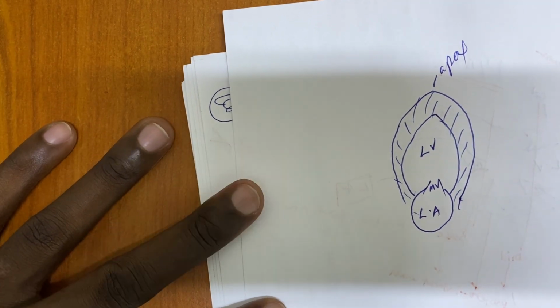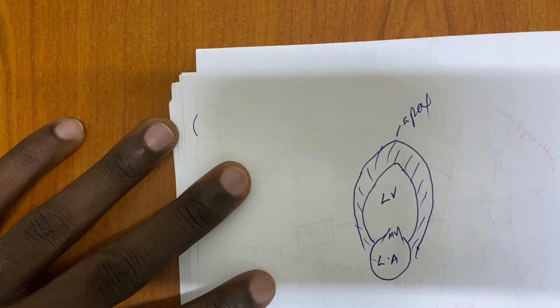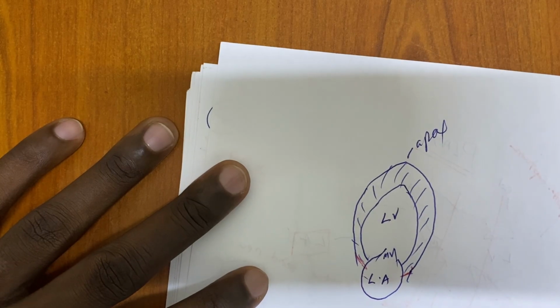Yes. So, if this is the apical two chamber, then in apical two chamber you're going to see anterior and inferior. Anterior and inferior.